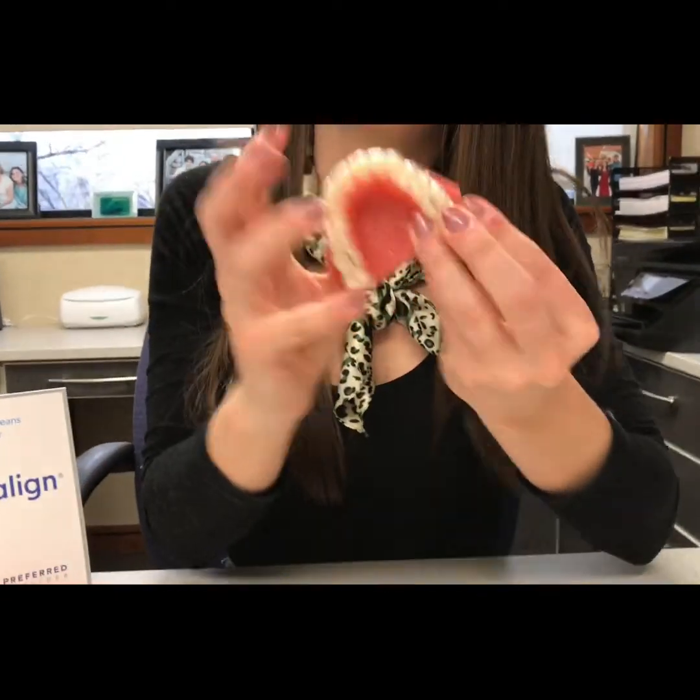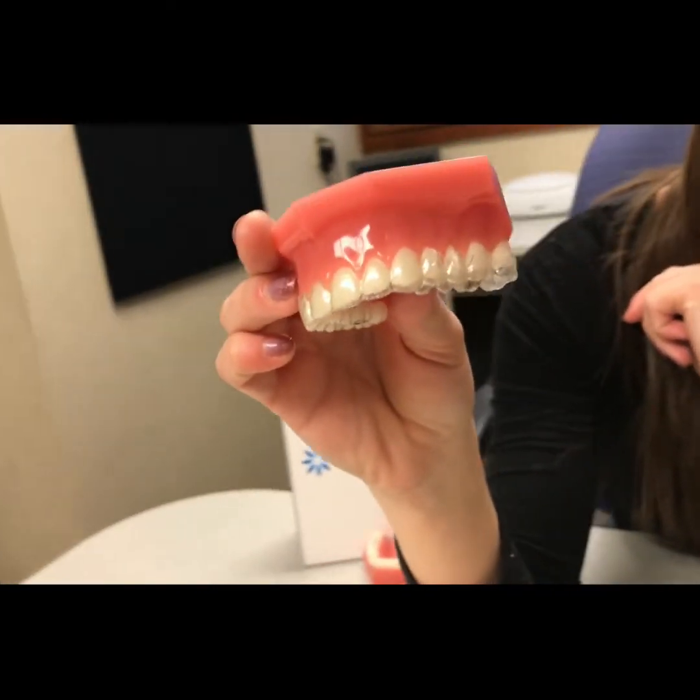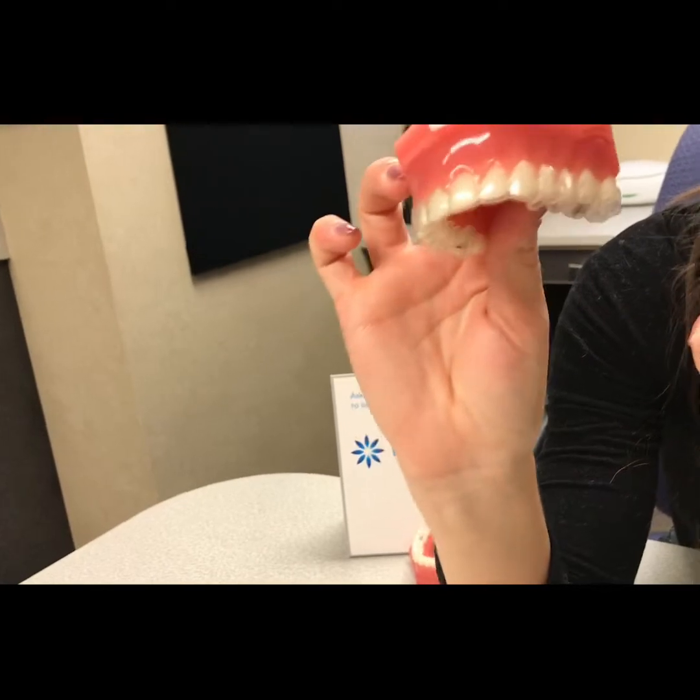Tip number seven: it's really important that when you put your new tray in, it doesn't float. What I mean by that is if the tray goes down all the way on one side but you can see that it's not fully seated on those teeth, that is what we mean by your trays floating. If that's the case, give your doctor a call. We'll make an appointment, check and make sure everything's still okay and we're still on track. Make sure you bring at least your two trays ahead — so whether you're on tray five, bring trays six and seven, and also the two trays behind, so four and three — so we can check if it's just that tray or if we are getting off track.